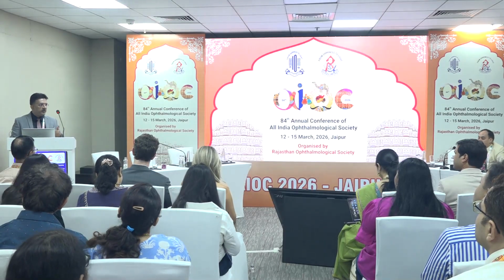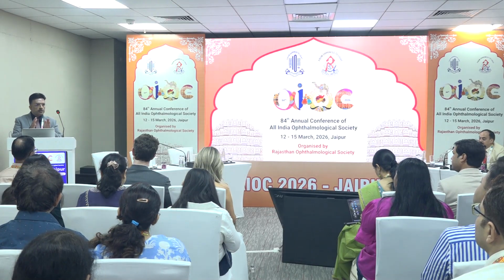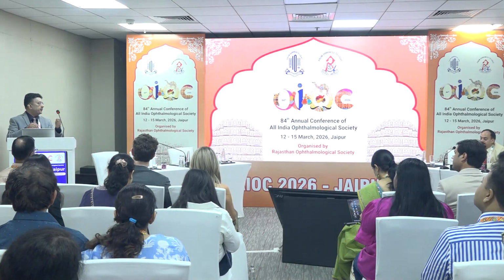Now, first thing that you will do is your IOP settings. You're going to have a low IOP. You're going to have a low AFR. If your AFR is less, the fluctuations will be less. Third is your incision, like I pointed out, it should be adequate. And if it's occurring, then what you can do, you can take a spatula and just go beneath the iris and just tent it upwards. So then the pressure normalizes and you can continue with your surgery.